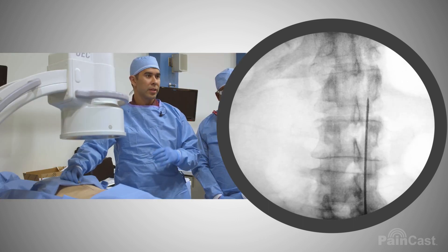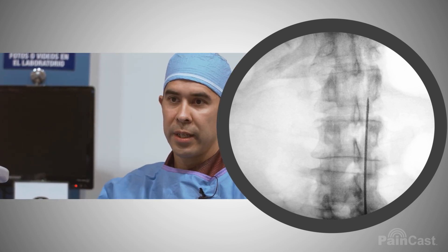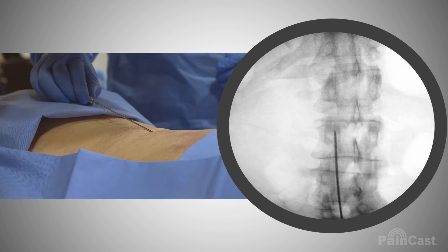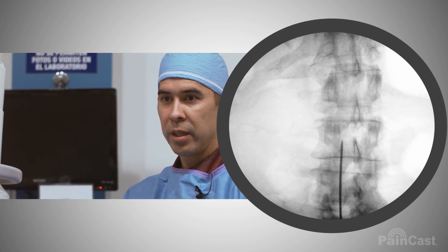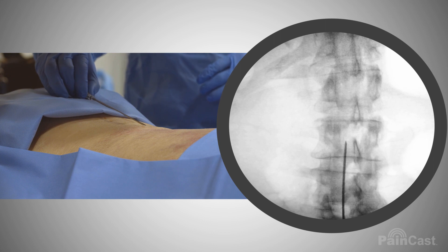Our target's going to be essentially right to the right of that needle. In order to get into that space, we want to be in the center of that interlaminar space. We're going to touch the needle essentially right here on the bone, but we're going to enter from the 9 o'clock position of the pedicle below.